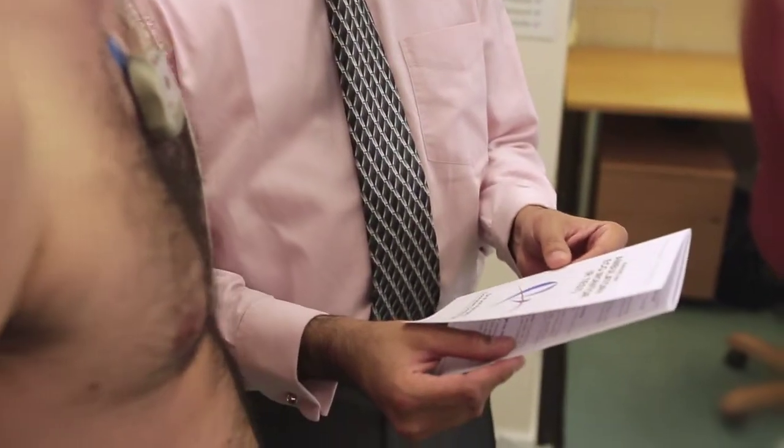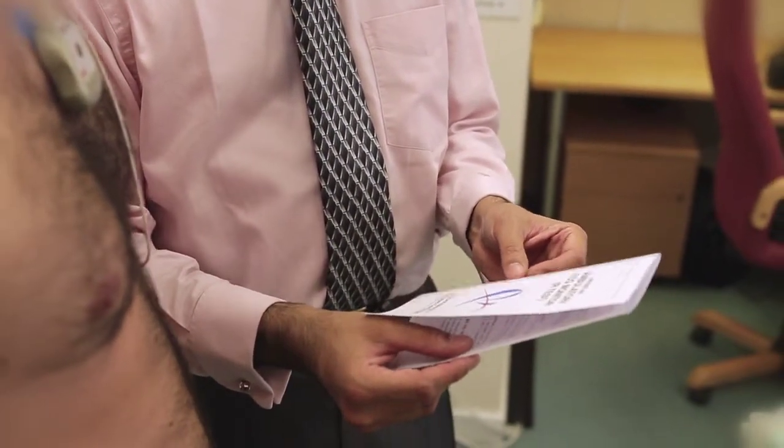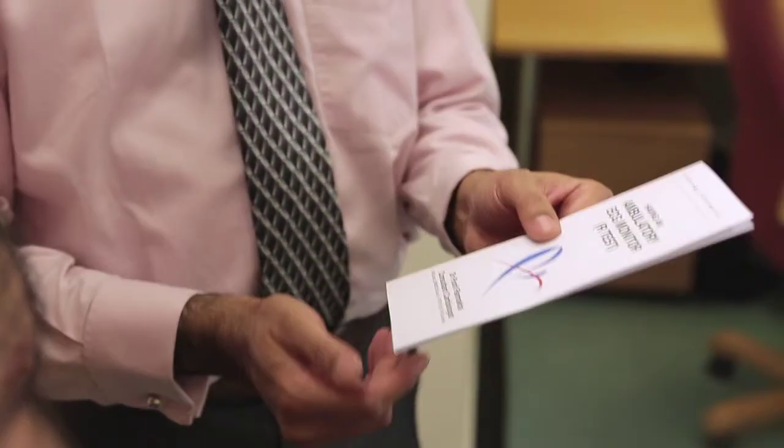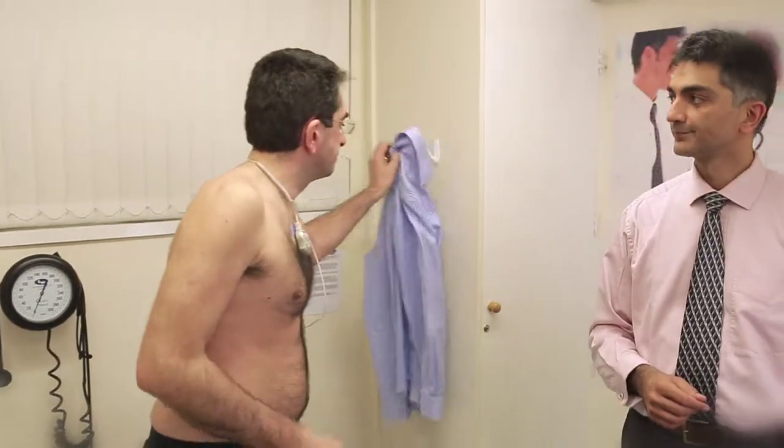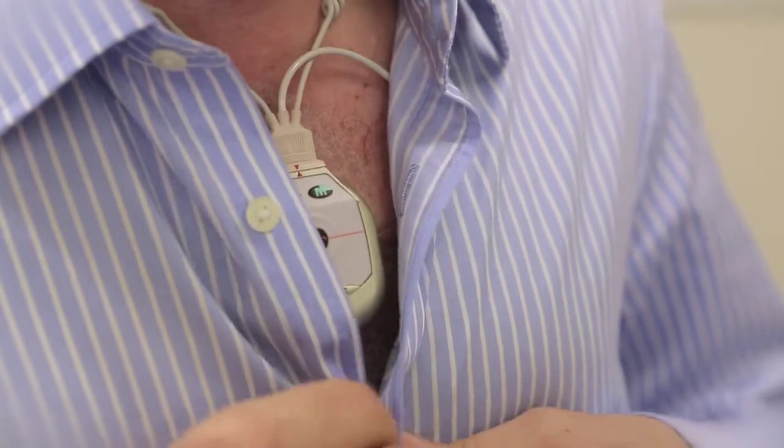The monitor is constantly recording with a timestamp on it, and so as long as the patient tells us when they get symptoms, we can always go back and see what was recorded at the time. The monitors that we use here in the clinic also have a button that the patients can press exactly when they have symptoms. And so it makes it easier to look back through the recording and find out exactly what the heart rhythm was doing.